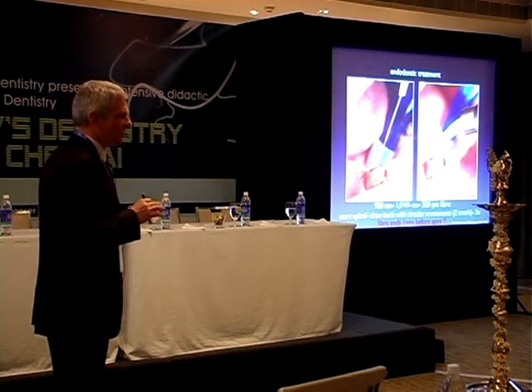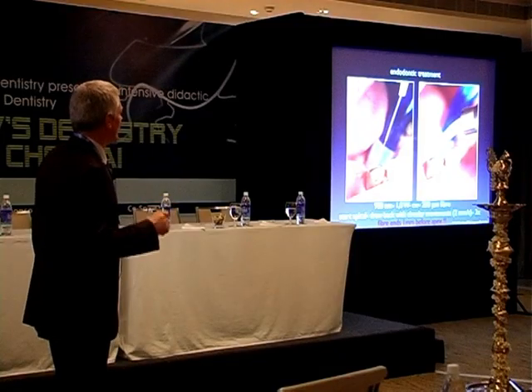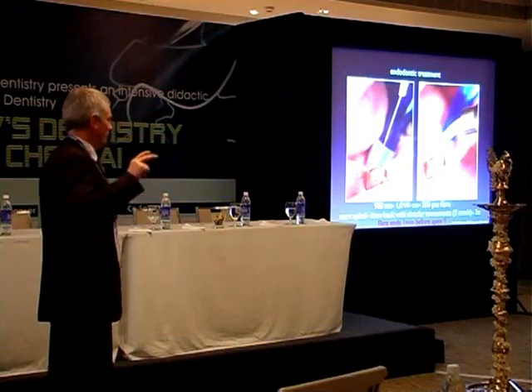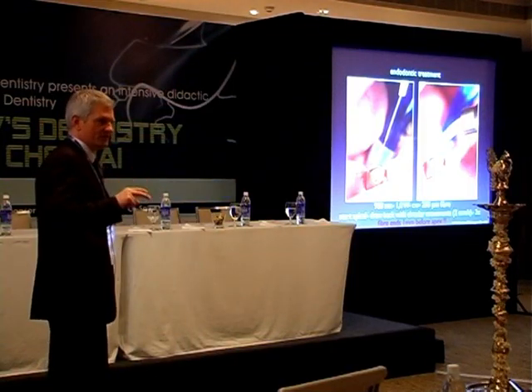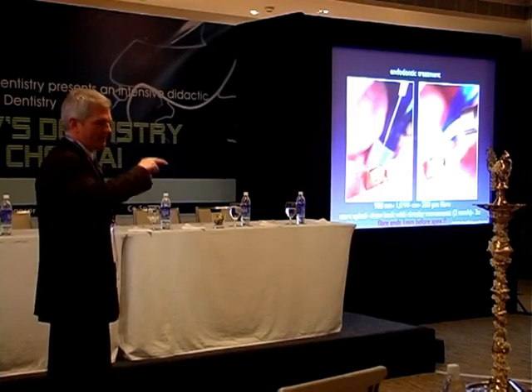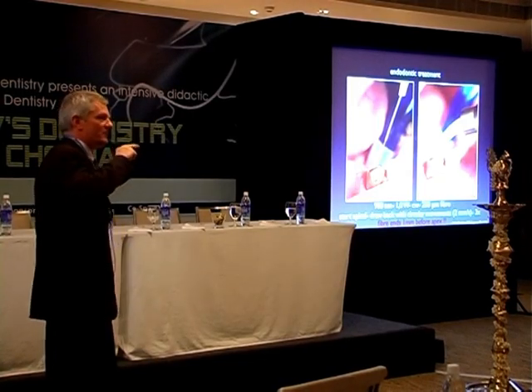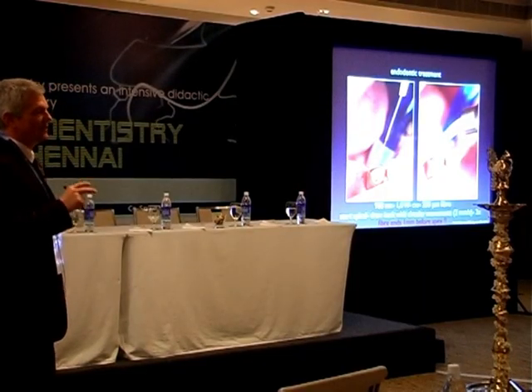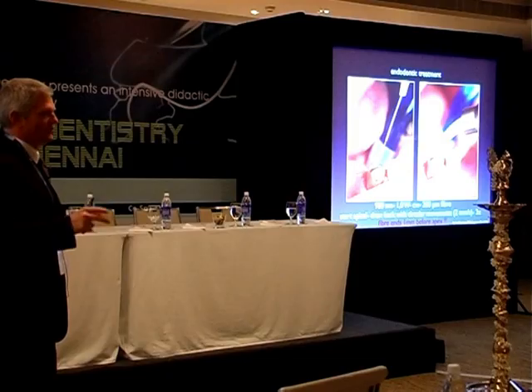But always be sure that you have prepared the canal up to ISO 30 or 40, because the fiber has 200 micrometers. So you must move your fiber in the canal, because if it's too narrow, you cannot move your fiber, and maybe the fiber will break in the canal and then you lose.